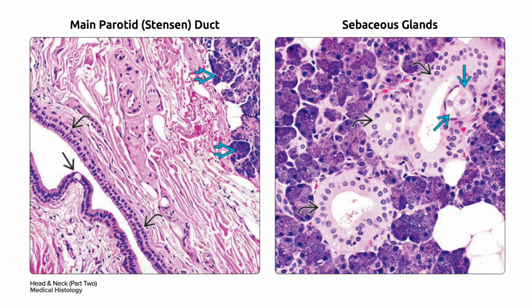On your right are focal sebaceous cells in a single blue arrow, or lobules, that are not uncommon in parotid gland duct epithelium in the curved black arrow. They can be seen in the majority of parotid glands with careful examination.